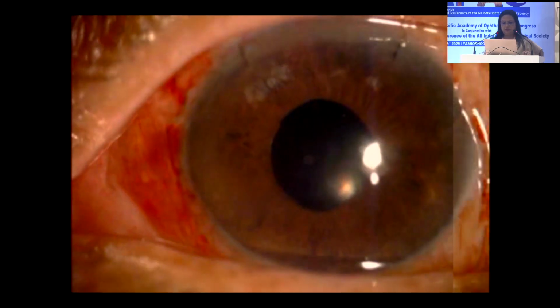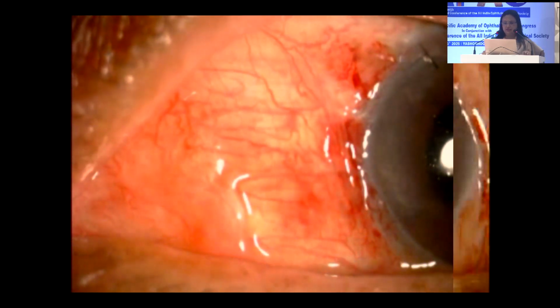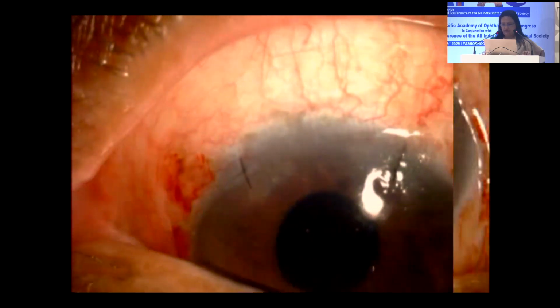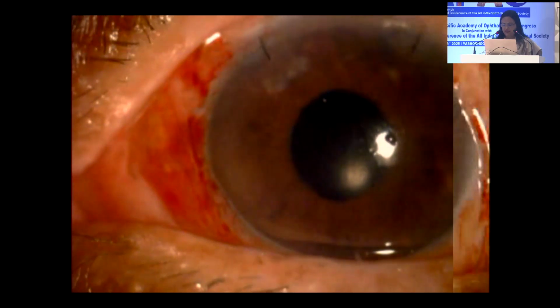This is a post-operative video of the same patient. You can see that on movement of the eye, there is no movement of the IOL, and he regained 6/6 vision. He was very comfortable with it. We have almost 7-8 years of follow-up with this patient, and he's doing very well.